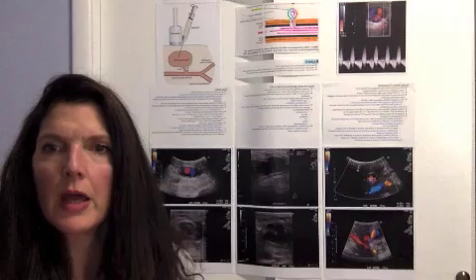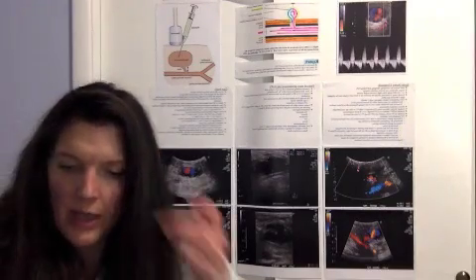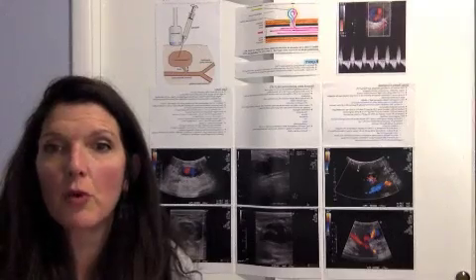Once you've identified a pseudoaneurysm, you want to measure the maximum dimensions and evaluate the flow in the adjacent artery with color and spectral to see if that's normal.